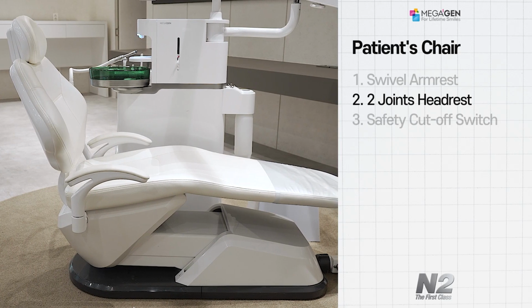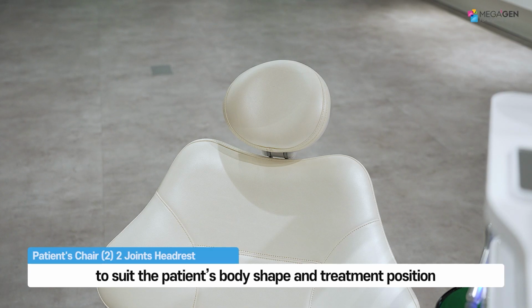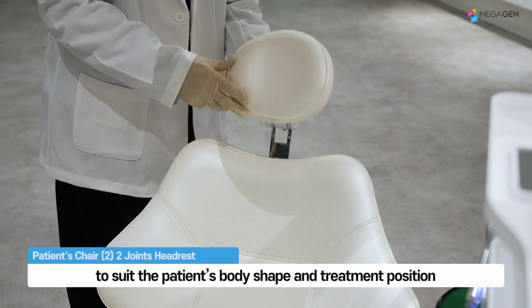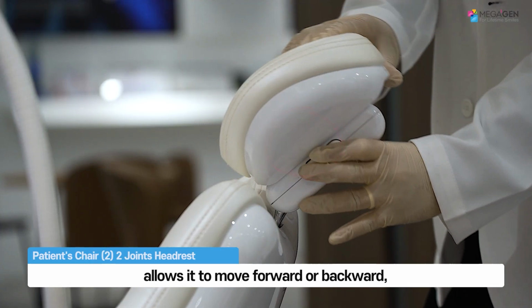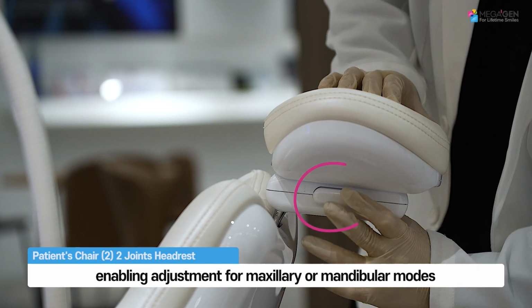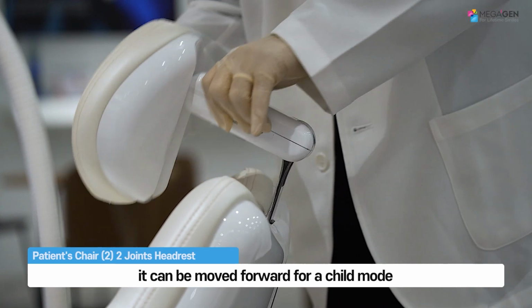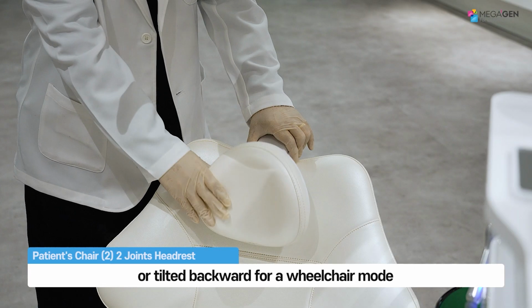How to adjust the chair headrest. The headrest can be adjusted up or down to suit the patient's body shape and treatment position. Pressing the button on the headrest allows it to move forward or backward, enabling adjustment for maxillary or mandibular modes. Using the two joints of the headrest, it can be moved forward for a child mode or tilted backward for a wheelchair mode.